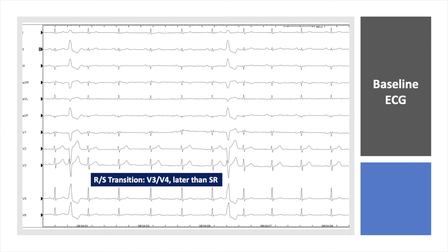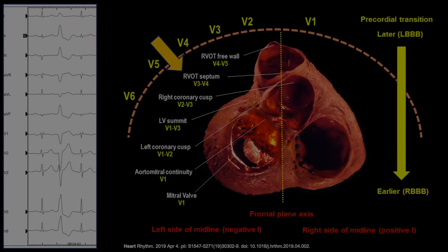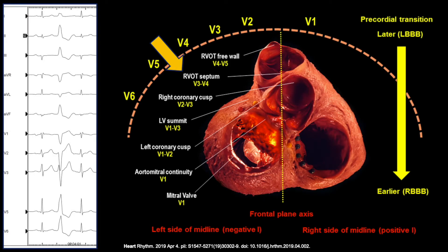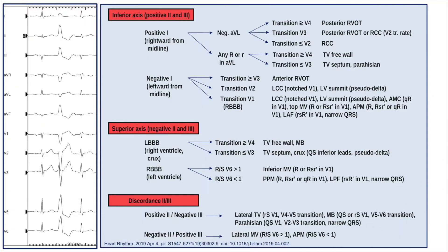The ECG shows frequent monomorphic PVC with left bundle branch block pattern and a RS transition around V3-V4, which is also later than sinus rhythm. This morphology is compatible with the septal region of the right ventricular outflow tract with a transition around V3-V4. This figure and the previous one are from an interesting review article which summarizes the application of ECG for localization of outflow tract.